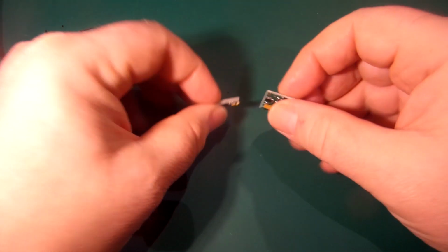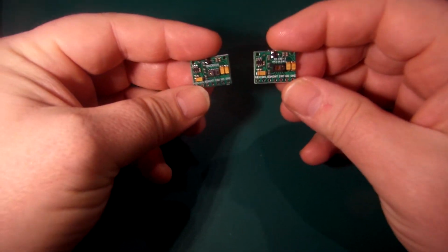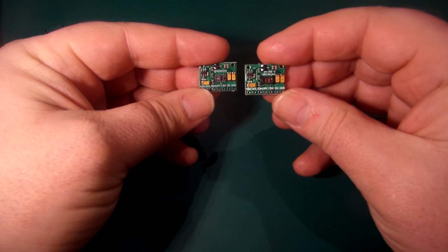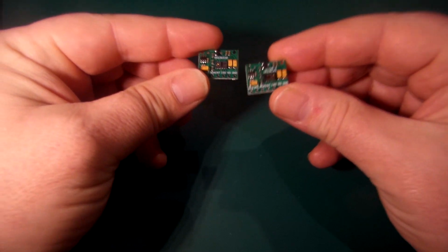So in this episode, we're going to look at these sensors. These actually measure pulse and oxygen levels. They may look identical, but they're not. Let's find out what the differences are and how we could use them with our Arduino.